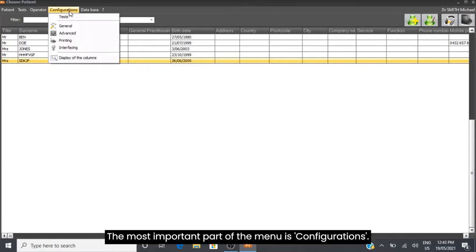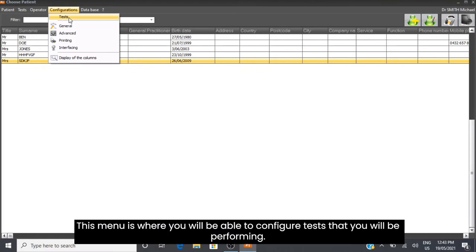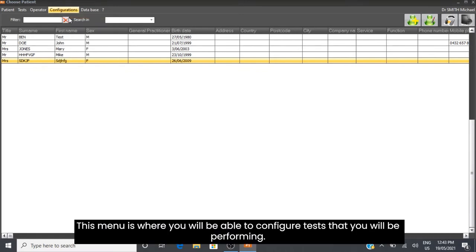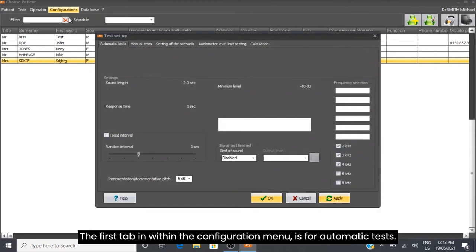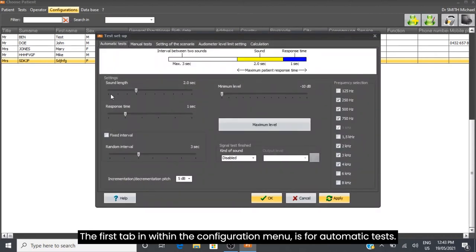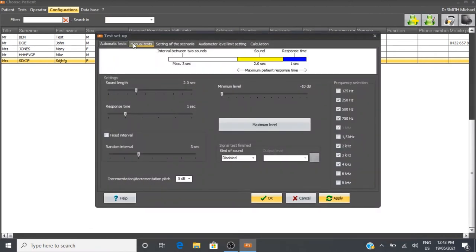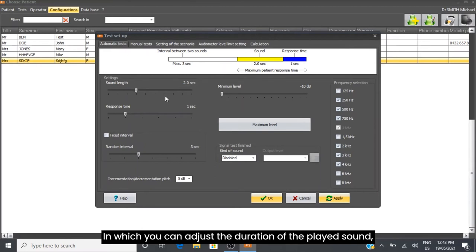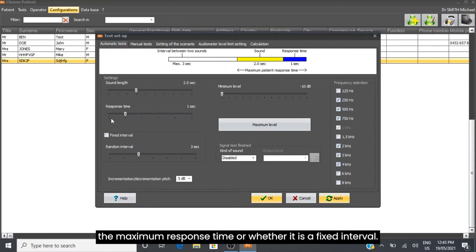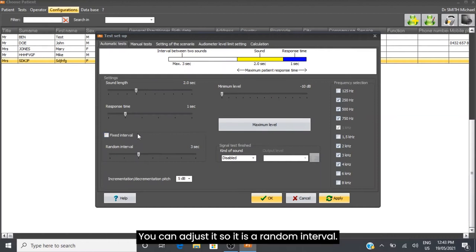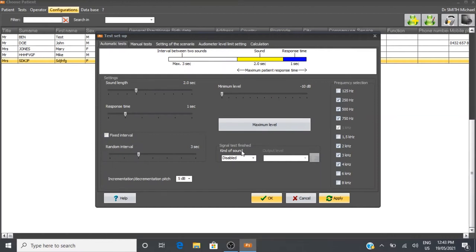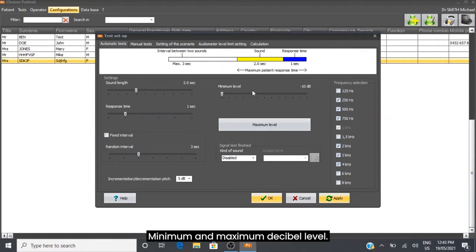The most important part of the menu is Configurations. This menu is where you can configure tests that you will be performing. The first tab within the configuration menu is for automatic tests, where you can adjust the duration of the played sound, the maximum response time, whether it is a fixed interval, random interval, and minimum and maximum decibel level.